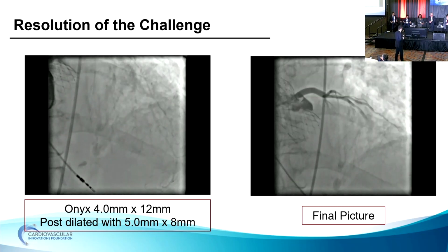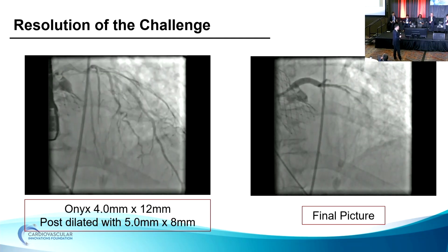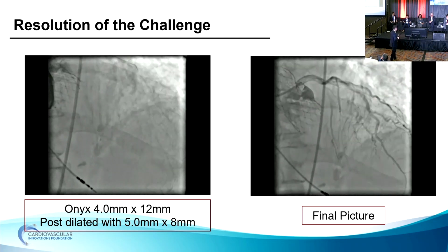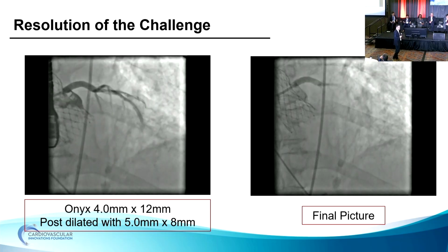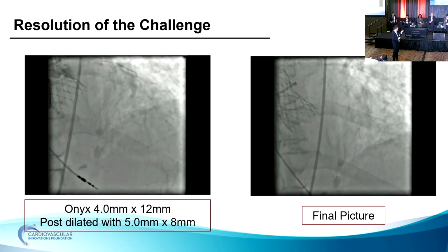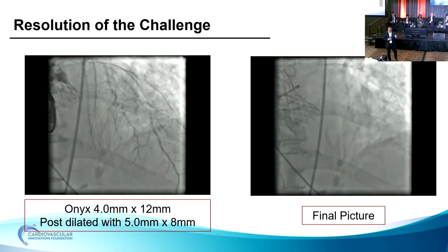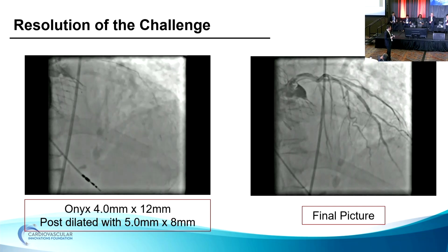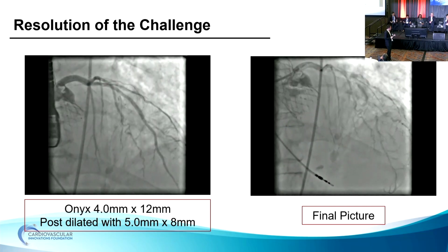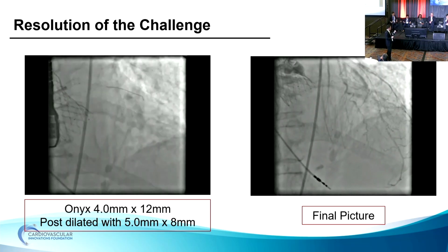So tell us about your stent. How far back are you? So we entered a few millimeters back. We did not want to cross inside the valve. We knew from the model that I showed you that your sinuses are actually large enough to allow for a few millimeters of your stent to protrude outside without really interacting with the valve frame. The reason we did that is because we didn't really know what was closing it. So we wanted to achieve compression of the ostium of the left main.